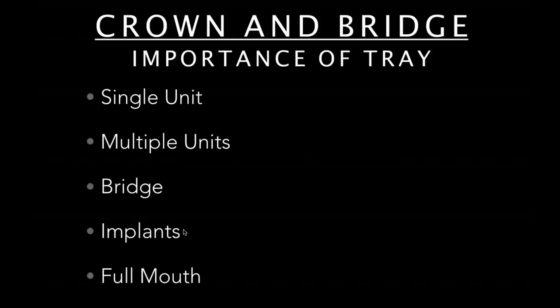The other thing that we want to talk about is the importance of the tray and isolation. I actually stopped packing cord in 1997. I do use a laser, but I do remove old PFMs, deep amalgams, deep restorations, and I use a laser. In the anterior, when I do a smile makeover, I make sure the gum is healthy. Again, my lab technician is so good that I barely get below the gum, the gingival height for my restorations, and they come out beautiful.